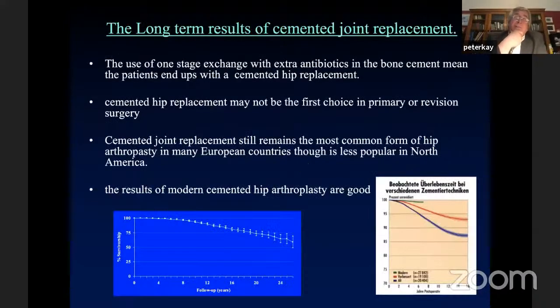Of course, you need to look at the long-term results, and cemented joint replacement does actually work quite well in the long term. But here's a real crux to one-stage revision, I think. And it's really the same with primary joint replacement surgery. At the end of the day, the whole purpose of the operation is to fix in an implant. So the most important thing in the decision-making, to me, is that after I've removed the implant, whether it be a hip or a knee, if I'm happy that I've got enough cancellous bone to fix in a new implant, then I feel really quite reassured. I'm happy to do a one-stage revision.